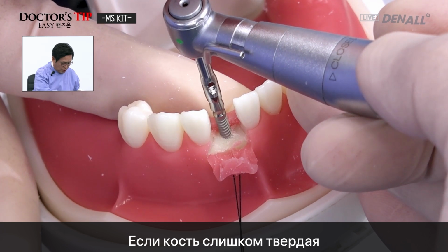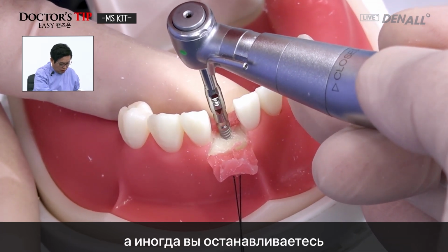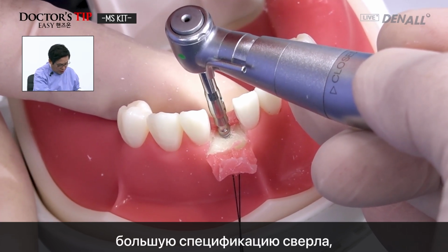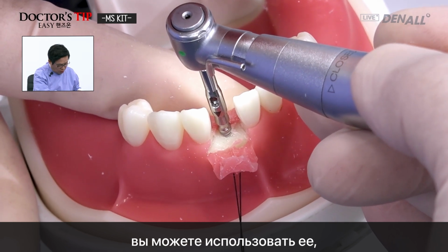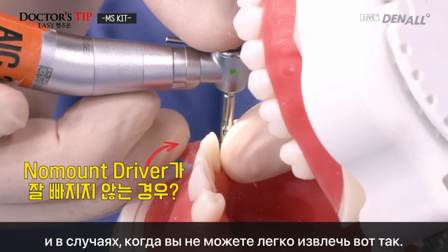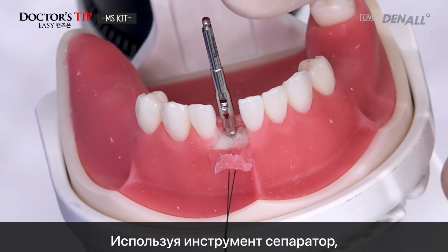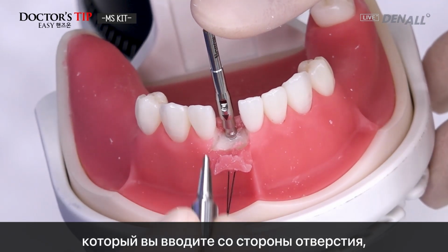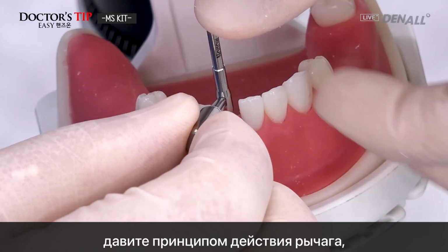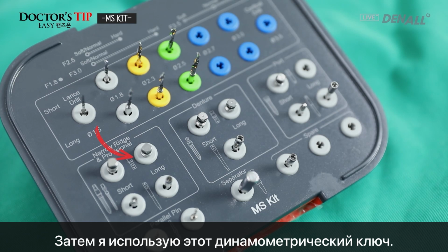If the bone is too hard and placement cannot be done fully, then sometimes you stop and use the drill one level higher, 2.3. You can use that even if it's not full length. And if you cannot take it out easily like this, in such a case, if there's jamming, then like this, using the separator, you put it in at the side and increase the lever action, then it can easily be disconnected or separated.